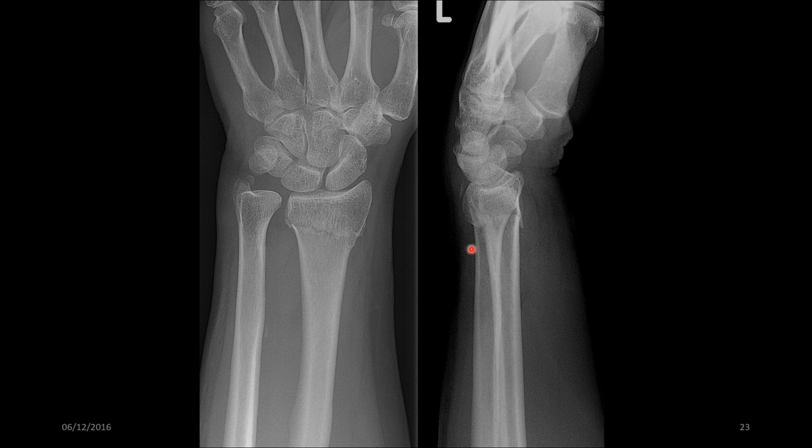So I was talking about the two orthogonal views. You have an AP or a DP wrist and a lateral. Don't worry about the AP and lateral terminology just yet, but it basically means one from the front and one from the side. And this here shows a distal radial fracture. So you have a look at it in that place. Oh, it doesn't look too bad. There's just a line through there. Well, actually, it has got a little bit of posterior angulation deformity. And it's a left wrist because of the marker there.